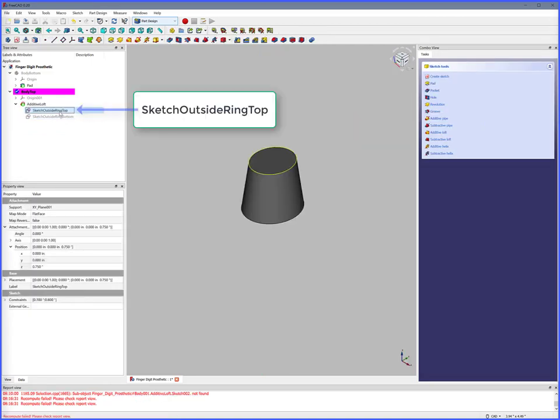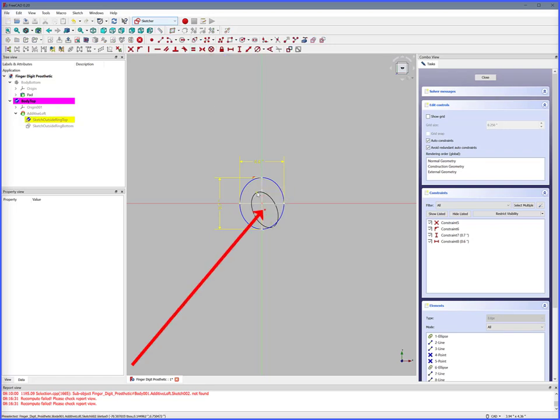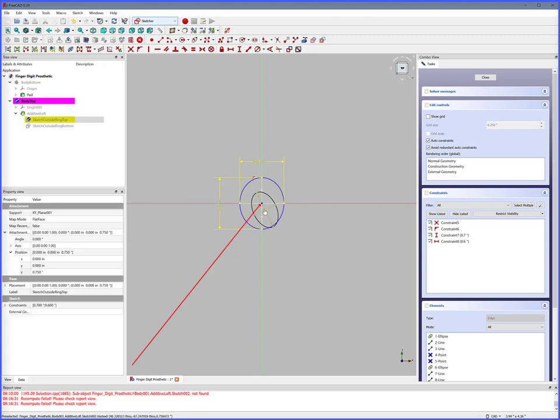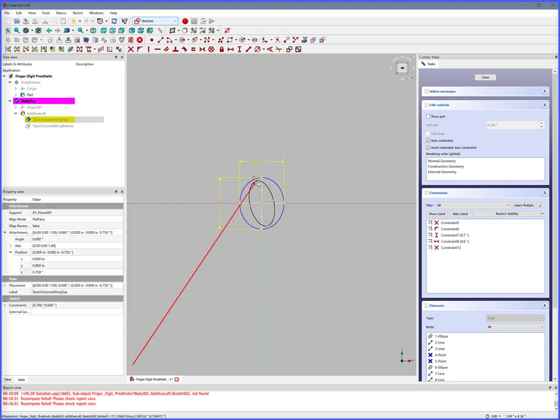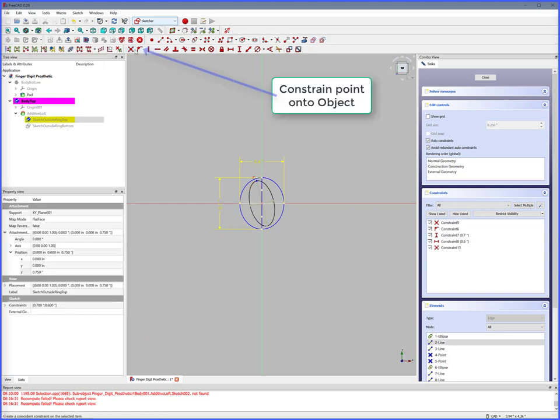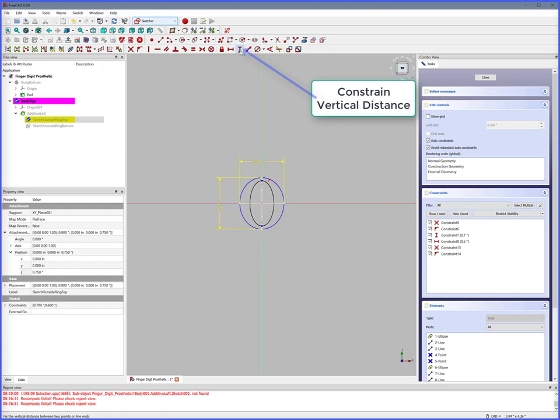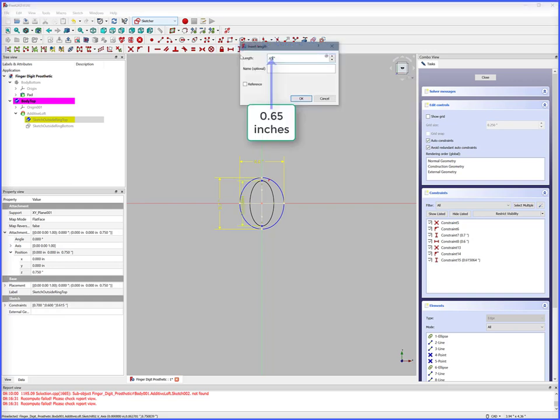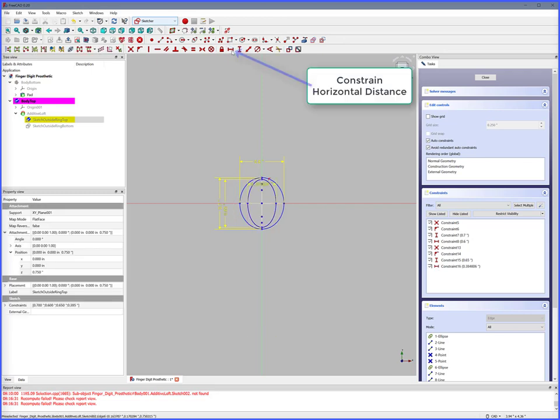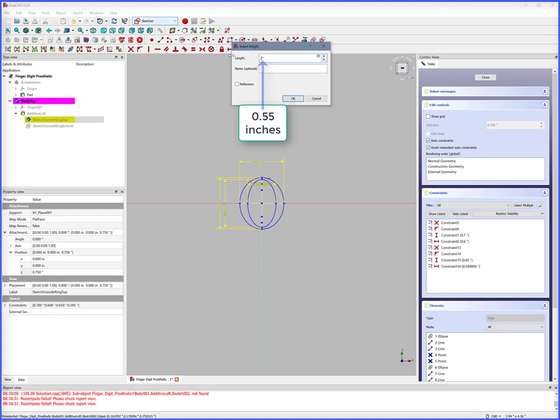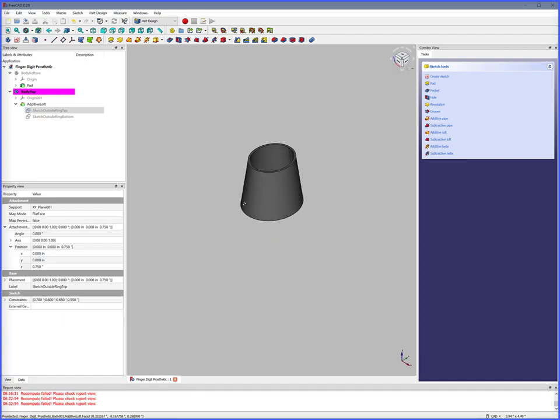Double click Sketch Outside Ring Top. Ellipse by center, click, double click to complete, right click to release. Select XY center, select center of ellipse, Constrain Coincident — now centered. Select ellipse point, select Y axis, Constrain Point Onto Object — now symmetrical. Select Y max points, Constrain Vertical Distance — cylinder inside Y diameter is 0.65 inches. Select X max points, Constrain Horizontal Distance — cylinder inside X diameter is 0.55 inches. Close. We now have an elliptical hollow sloped cylinder.